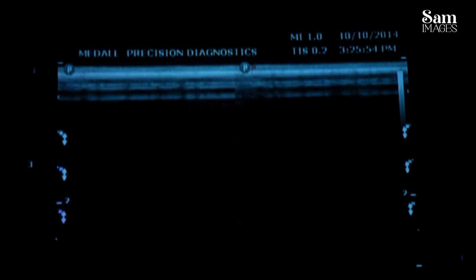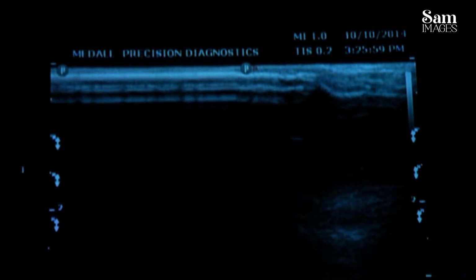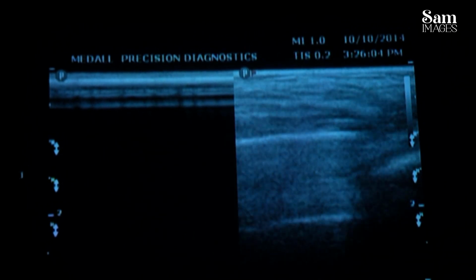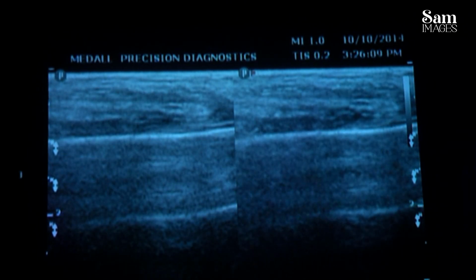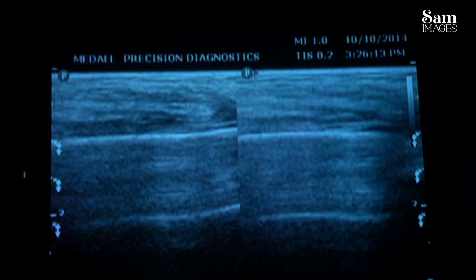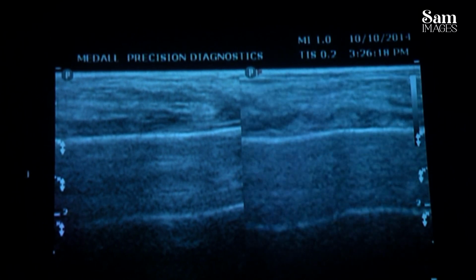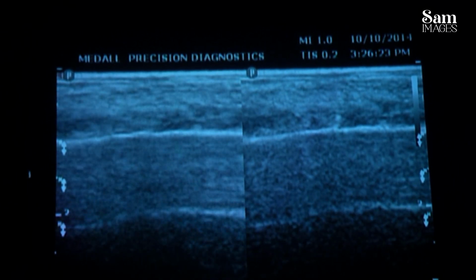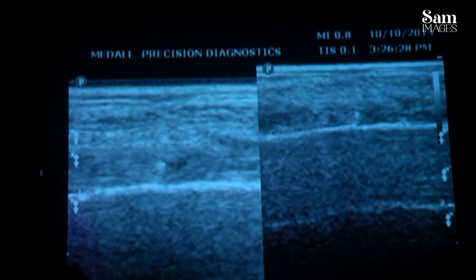Okay, see, after seeing this one, no, first you have to see it in the vertical position, madam. Longitudinally, take it this side. I am just keeping it longitudinal. When I do a cross section, this is the cross section, but first you have to do it along the line of the mandible and look for any pathology in that. Zoom it, increase the depth. Yes, okay, that's fine.